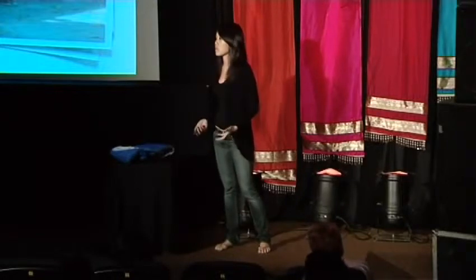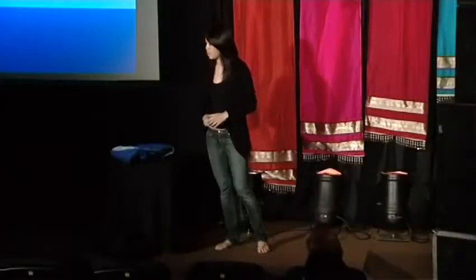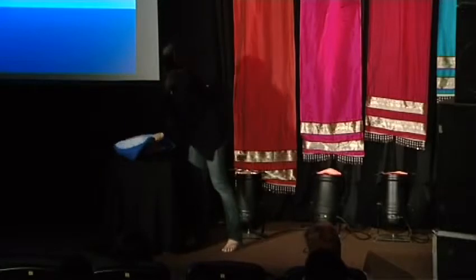Inspired by this story and dozens of other similar stories like this, my team and I realized what was needed was a local solution, something that could work without electricity, that was simple enough for a mother or a midwife to use, given that the majority of births still take place in the home. We needed something that was portable, something that could be sterilized and reused across multiple babies, and something ultra low cost compared to the $20,000 that an incubator in the US costs. So this is what we came up with.